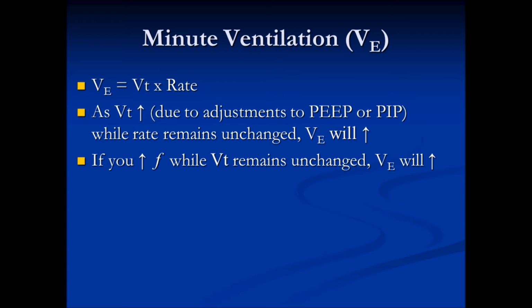So remember, you cannot directly make a change to tidal volume unless you're in volume guarantee. Therefore, tidal volume changes occur because you are either manipulating your PIP or your PEEP.